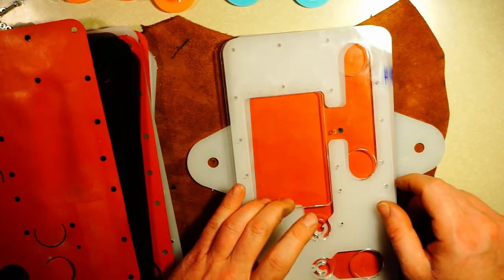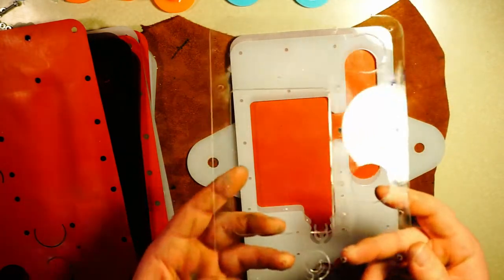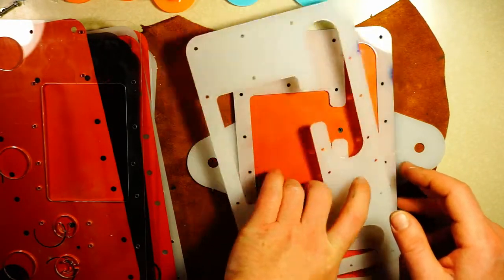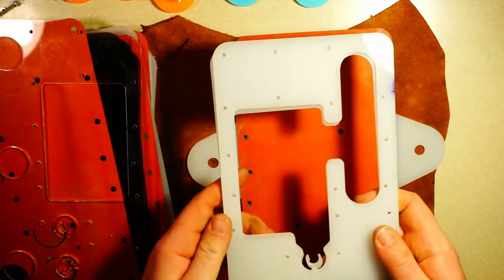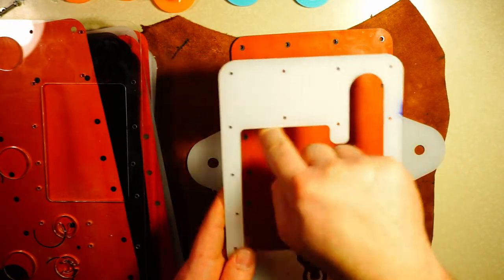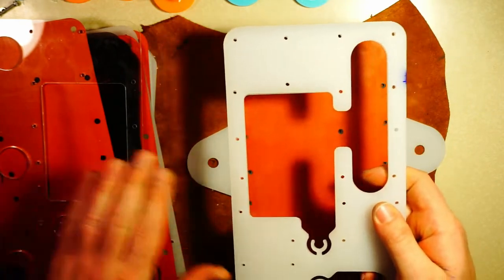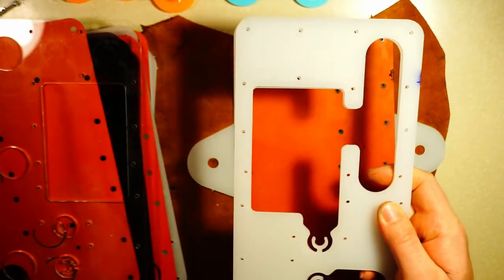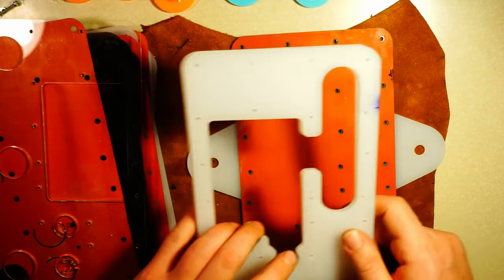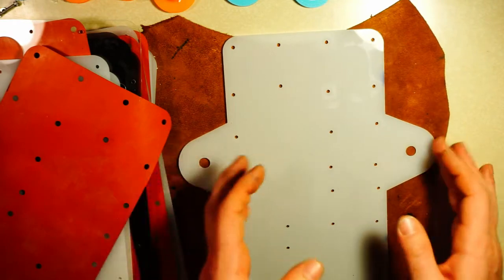Then we have these pieces of acrylic. First, a top backing plate here. Let's take a look at this white one because it's a little easier to see. Again, this is in from the pump over here, and then this is the chamber that forms the gate of the pressure gate valve. This will either push or pull a membrane sealing the patient and PEEP chambers within the pump. And then last but not least, we have one more seal and the backing plate.